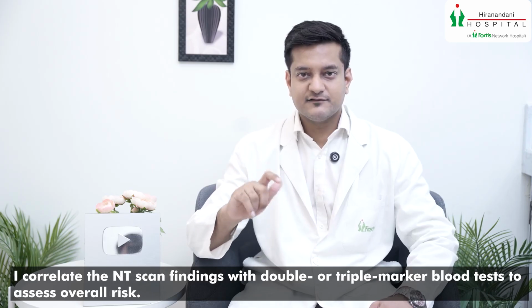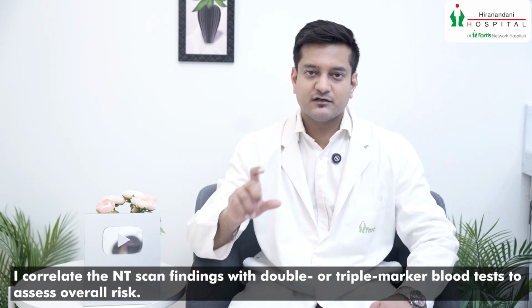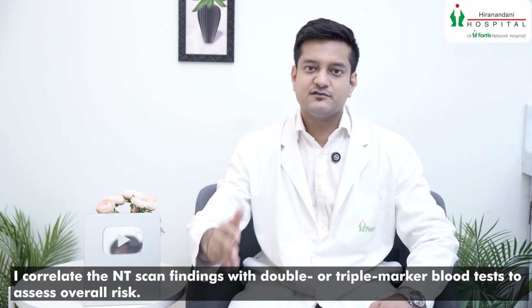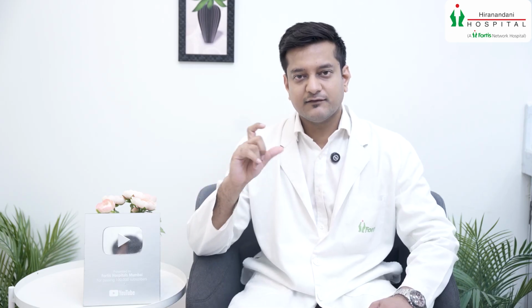This NT scan's result is correlated along with the double marker or triple marker test. Together one result comes which tells us the probability of having abnormality. If these values are within normal limits, the probability of having any genetic abnormality in the baby, especially these 3 trisomies, reduces significantly.